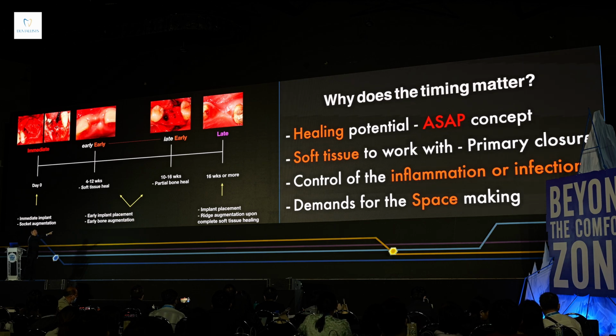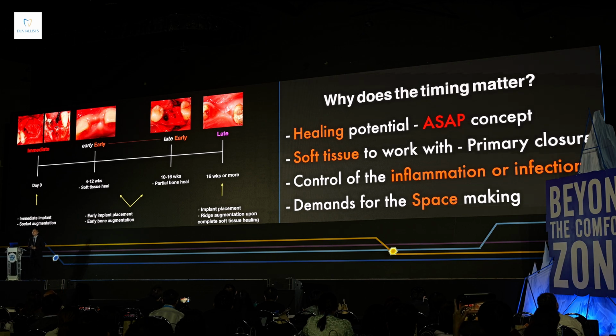And if we wait too long, because of the soft tissue issue, then I need to wait quite long, up to 16 weeks. Then we are having the late approach, which means that we need to use something stronger, the non-resorbable membrane, for it.